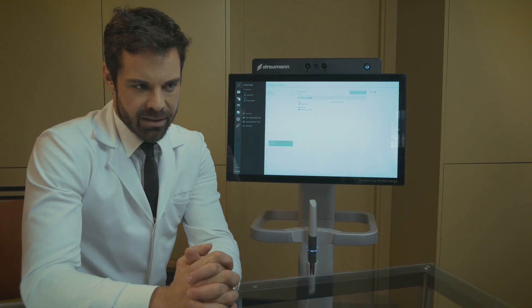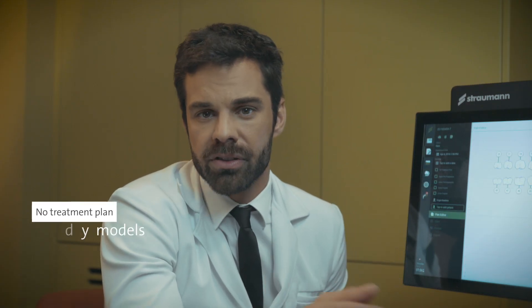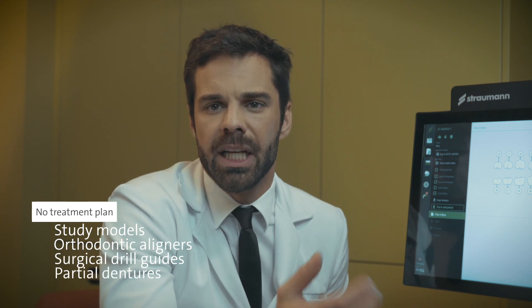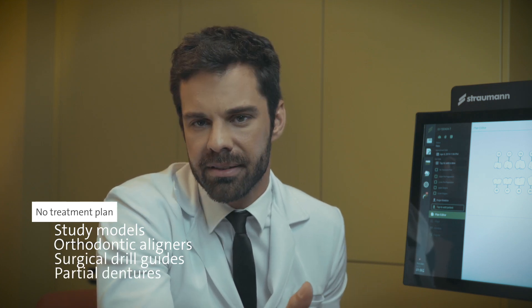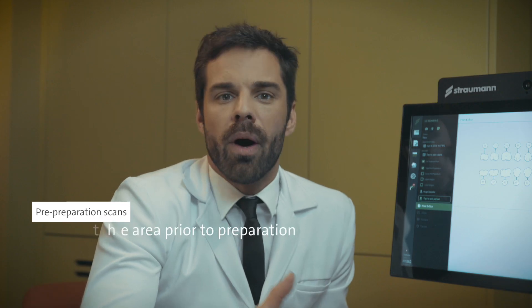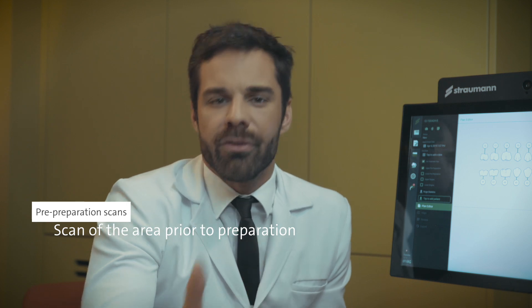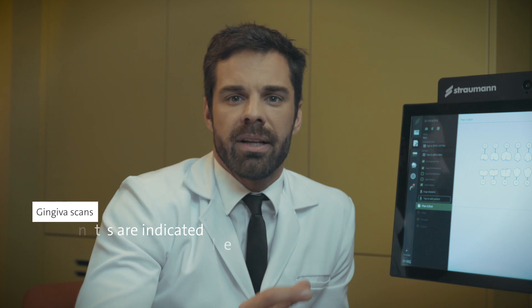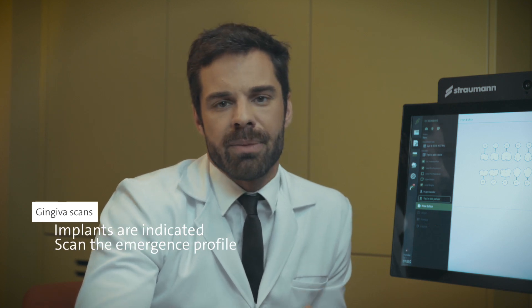Let me give you some tips about the Straumann intraoral scanner. No treatment plan use — study models, orthodontic aligners, surgical drill guides, and partial dentures — you can't select the teeth because it's a general scan. Pre-preparation scans allow you to acquire a scan of an area prior to preparation. Select the gingiva scan when implants are indicated, to scan the emergence profile before.